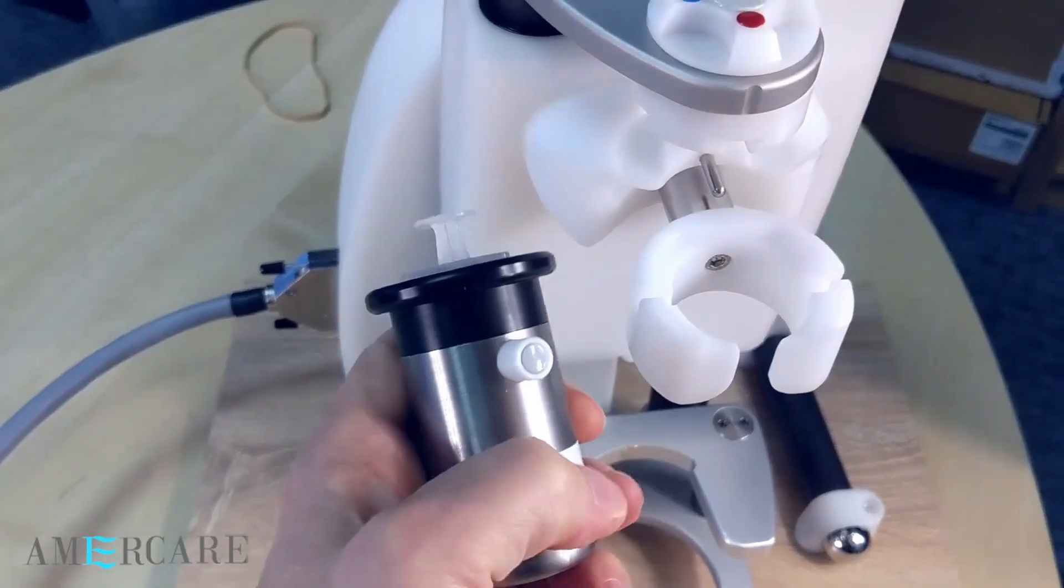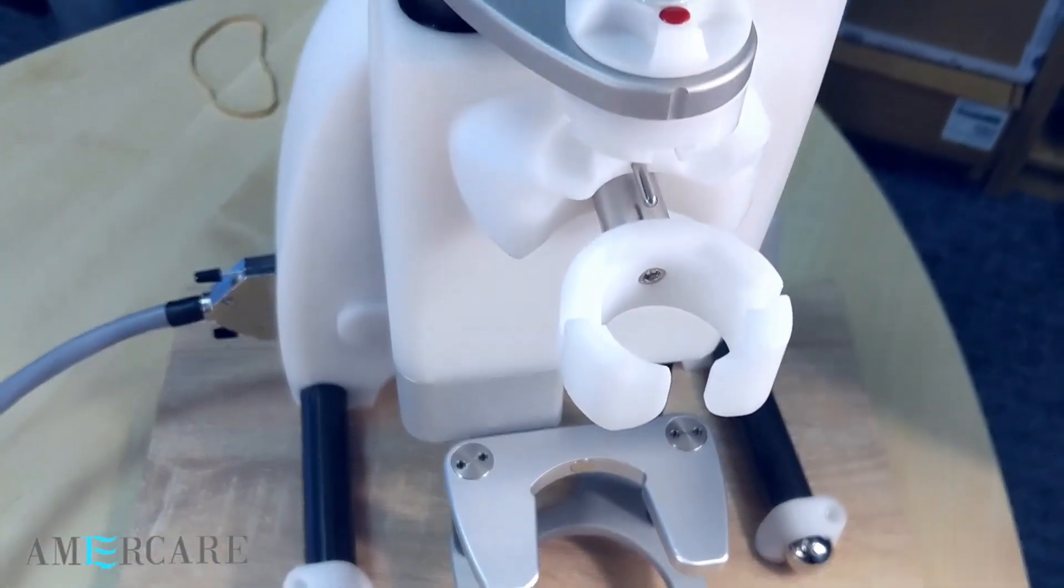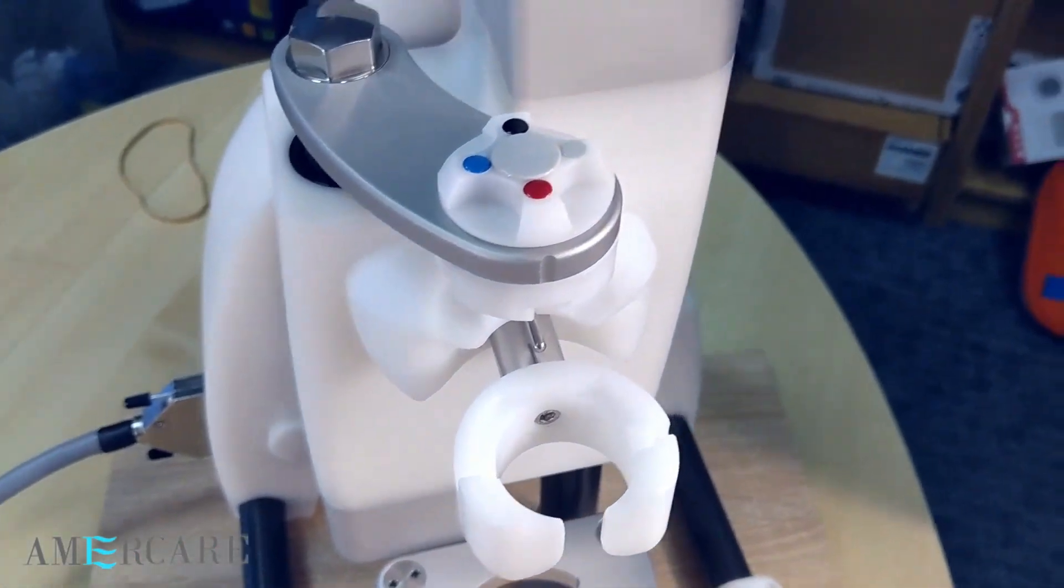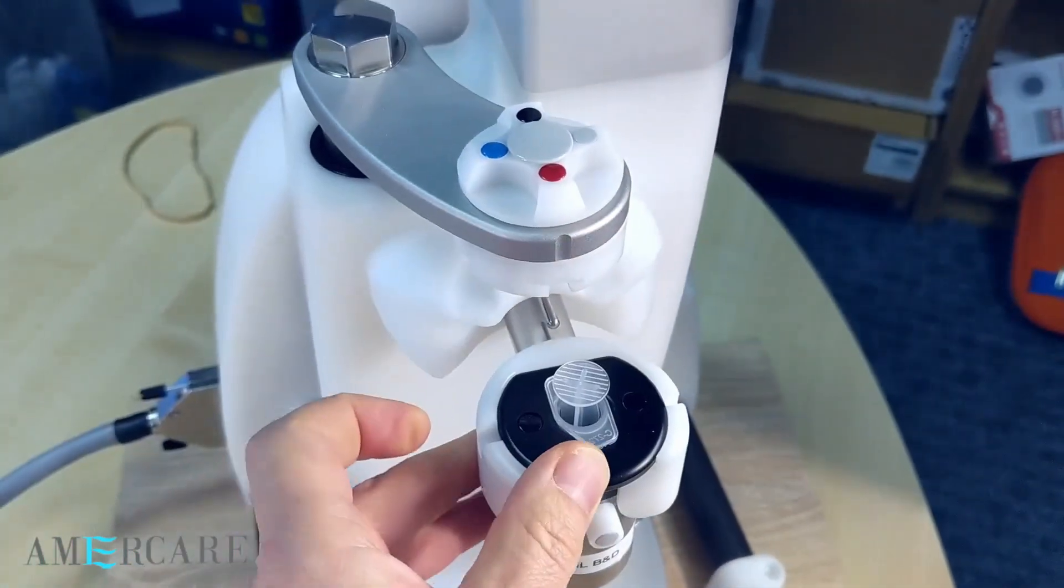So when fitted, ensure that the colored cap on the syringe shield matches the colour on the cap on the dial. For example, this is a 5ml B&D syringe shield. This has a grey cap, so we need to rotate the select on the top of the unit to the grey position.